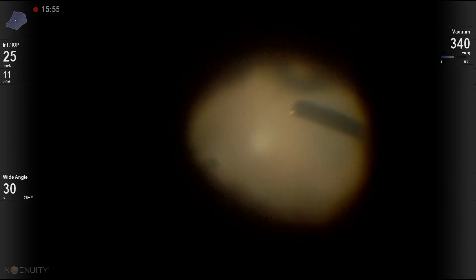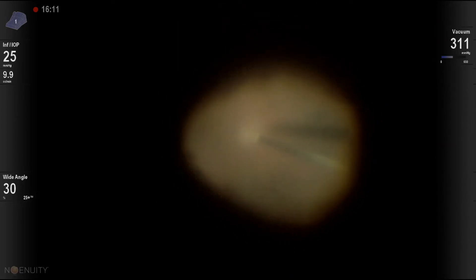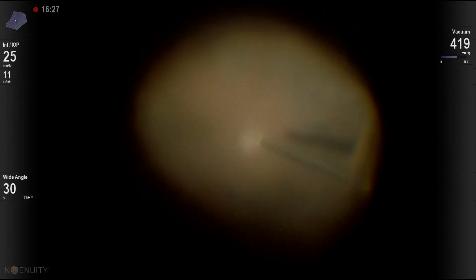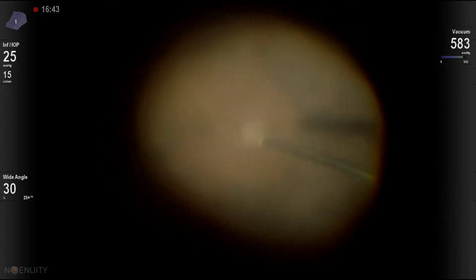The guiding rule of vitrectomy for endophthalmitis is to be very conservative. You want to see the disc — it is a vision-proportional vitrectomy. So when you cannot see, you have to stop. Here we're clearing the fundus.